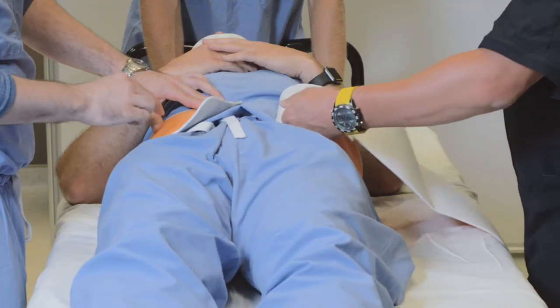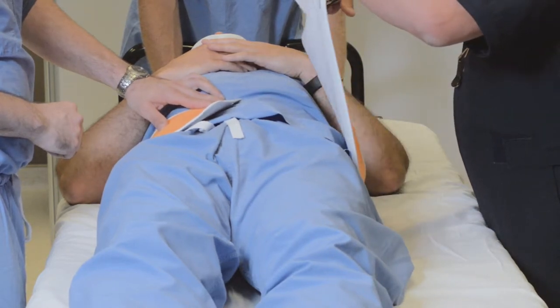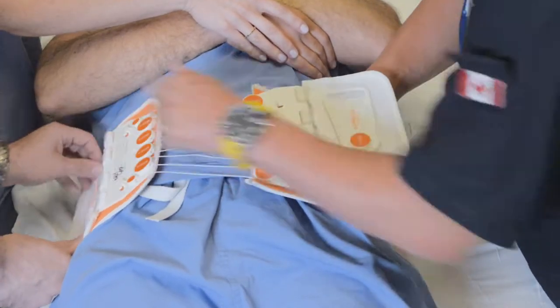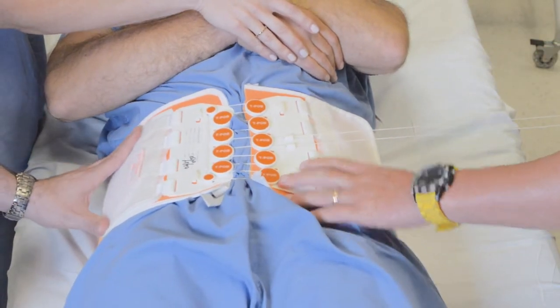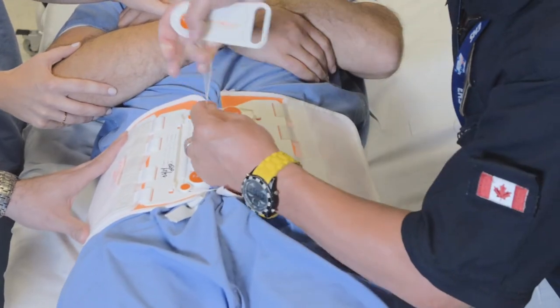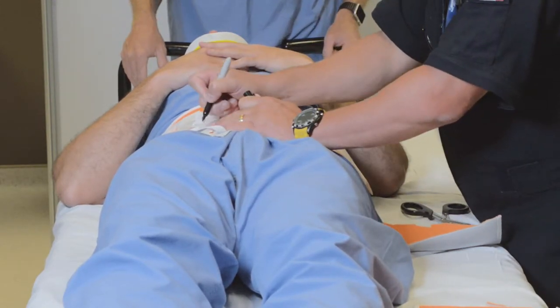From here we're going to measure up the binder. Do not fold this binder — it is a one-time use only. We're going to cut it at the measuring point. There needs to be about a six to eight inch gap between each end of the binder, then place the Velcro and pull it circumferentially until it's in place. Once that's done, wrap your cords through your hooks and write down the date and time of when you placed the binder.